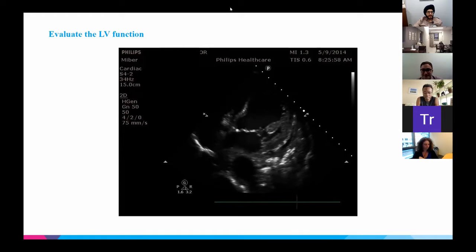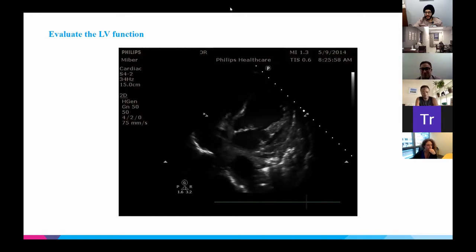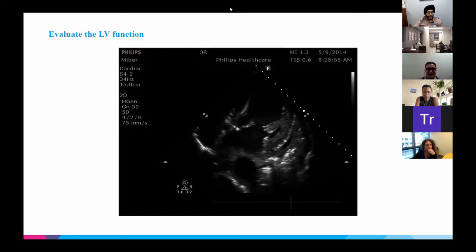Almost there, 37. I think we've... 38. Yeah. Okay. Should we just close it here? 38. Yeah, that's fine. Yep. All right. And then can we actually see?